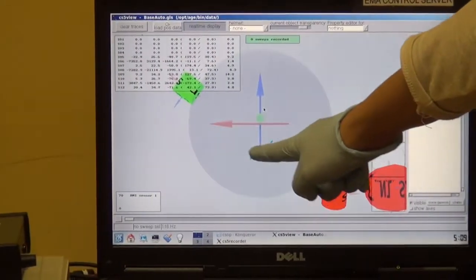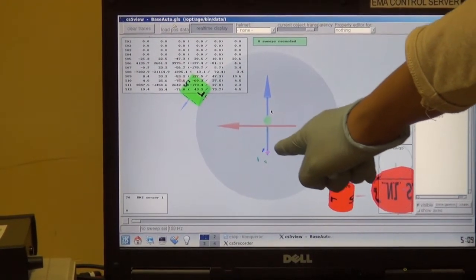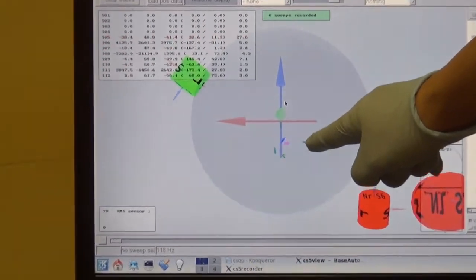You see this? These are the two tongue sensors, the two lips, the two upper and lower gum sensors, and this is the tongue tip.